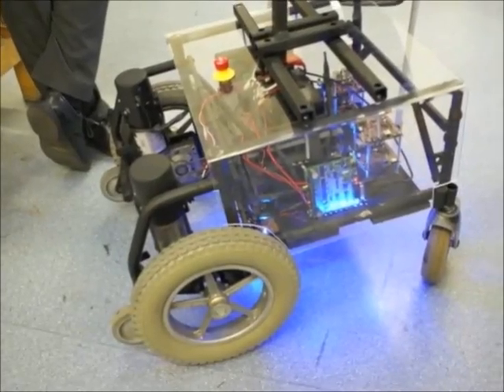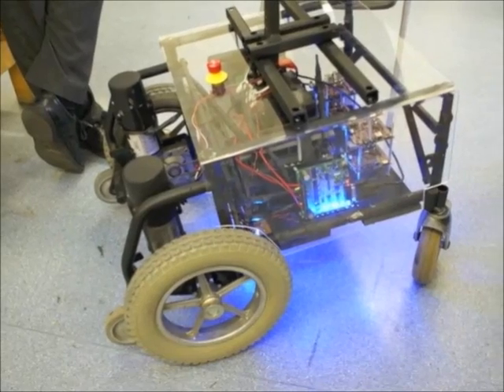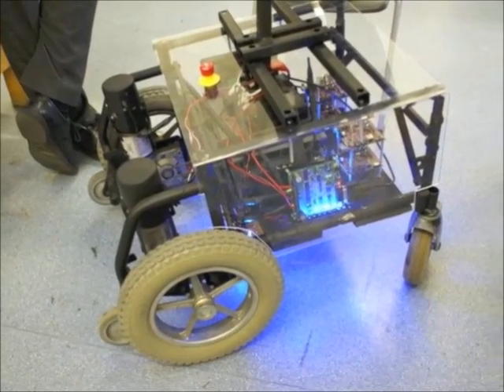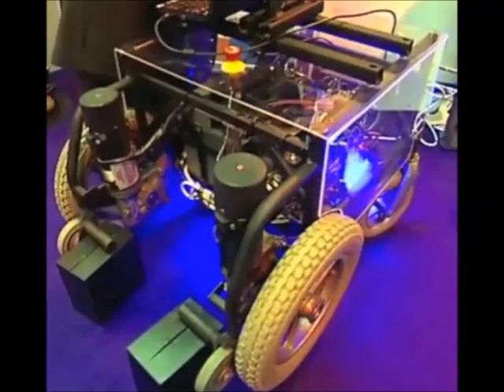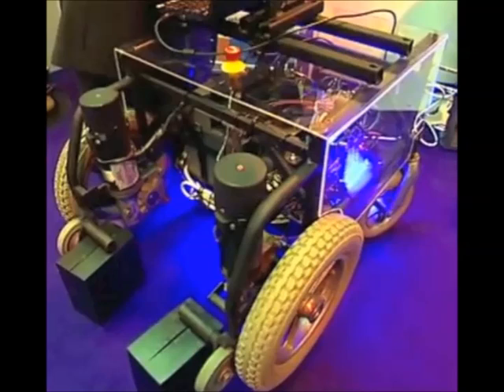The prototype for the project has been built around an electric wheelchair frame. This is an ideal platform for testing, but the final version will be much lighter and smaller.